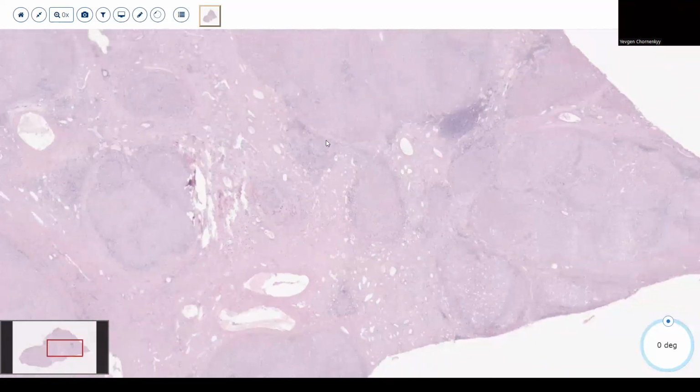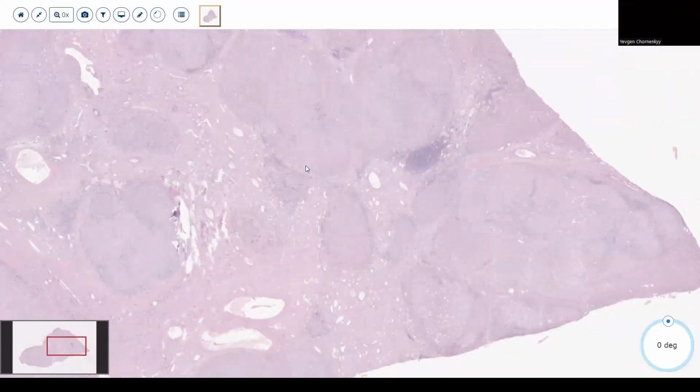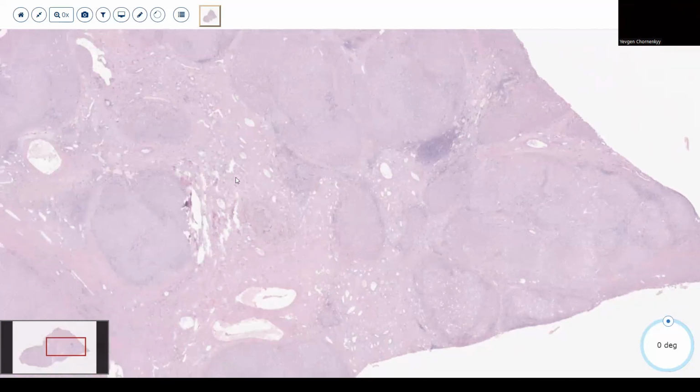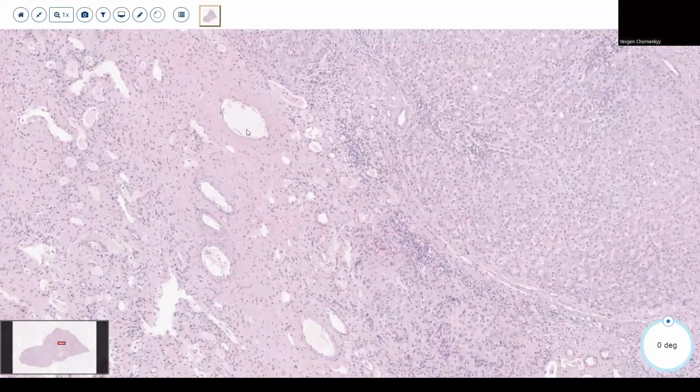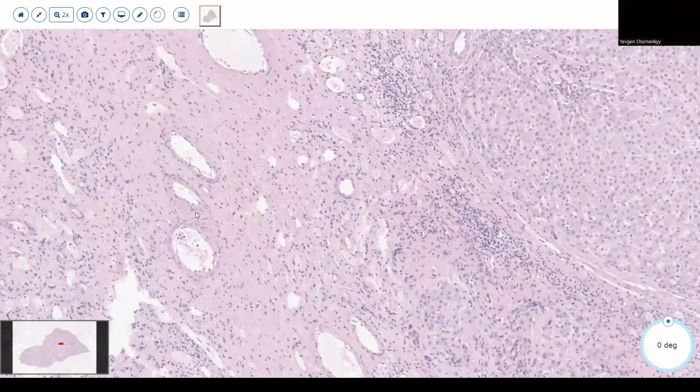Hypothetically, if you were to biopsy this, you could think maybe this is cirrhosis, right? You would get a trichrome and you'd be concerned for that. But here you're looking around, and what do you guys think these thick muscular things are right here? Yeah, totally.